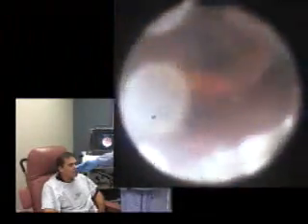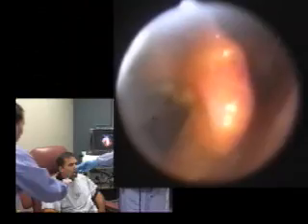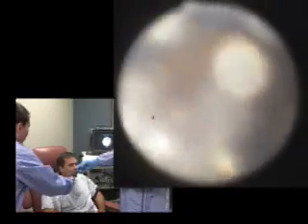Very good. So now let's see if we could have him swallow some colored material so we can observe its passage through the pharynx. Now, Chuck, hold this colored fluid in your mouth as long as you can.